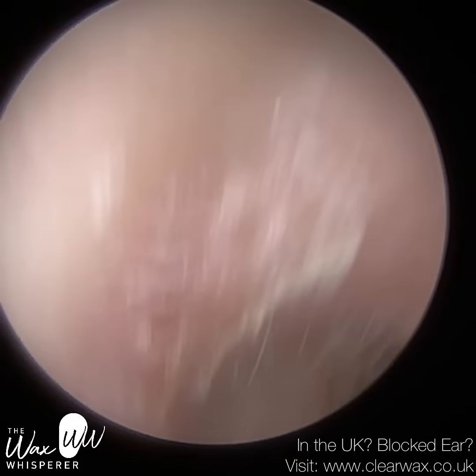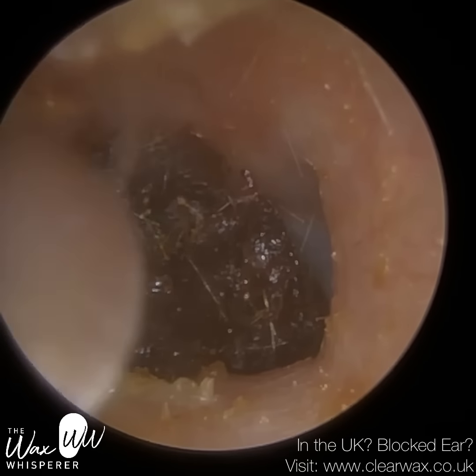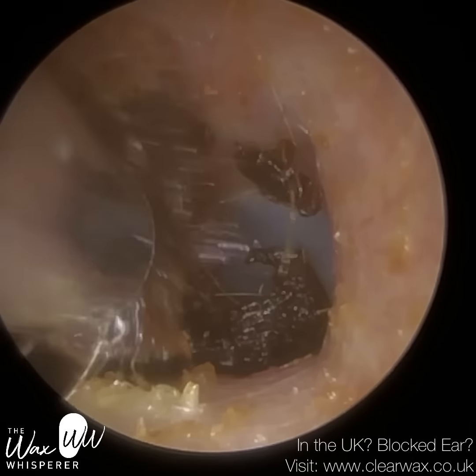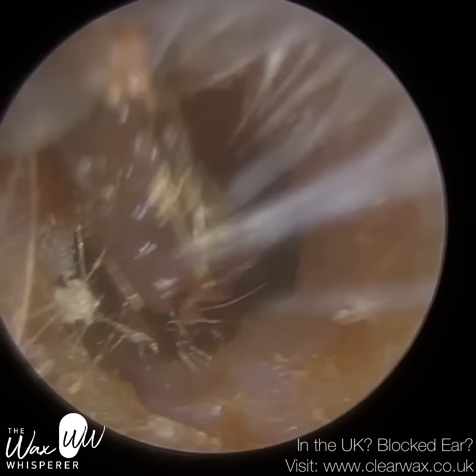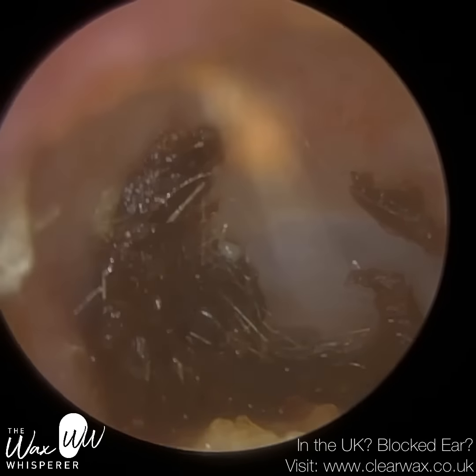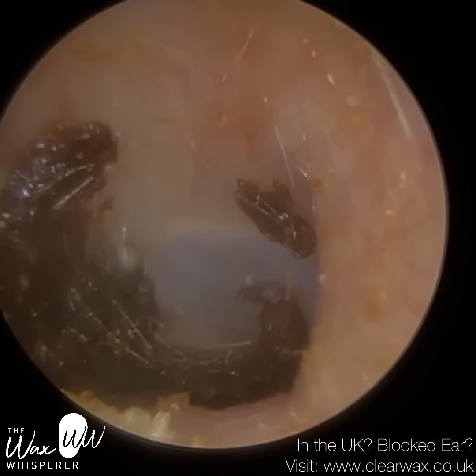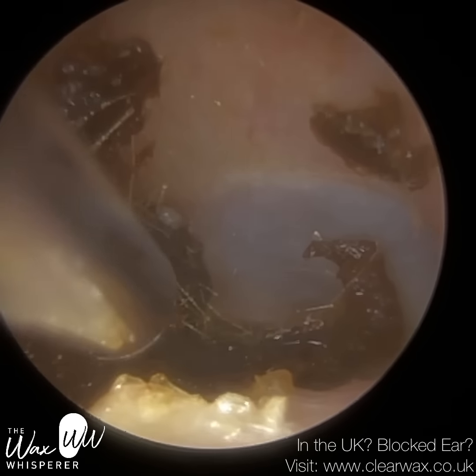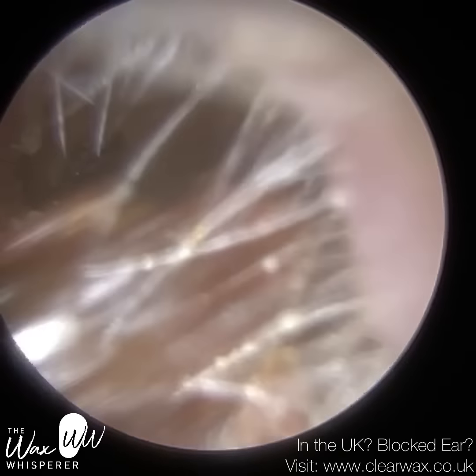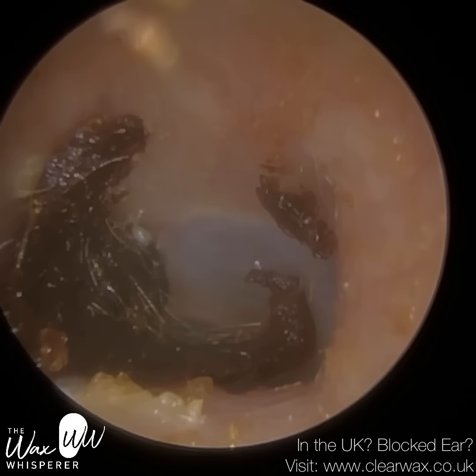So again, I managed to remove quite a significant piece of wax, and I thought, well, that's all of it. But you go back in, and the wax just kept appearing. Every time I was removing it, I thought it was the last piece. And same with the end there. I thought when I remove this, it'll all come away in one piece, but it didn't. So we can see probably half of the eardrum now. And I think I'm going to revert to a fine end suction probe, just so I've got a bit more manoeuvrability. I needed the power of the standard Zollner suction probe, but I was lacking with the manoeuvrability, and I wanted to go to the front part of the ear and also to the roof to remove this remaining piece of wax.